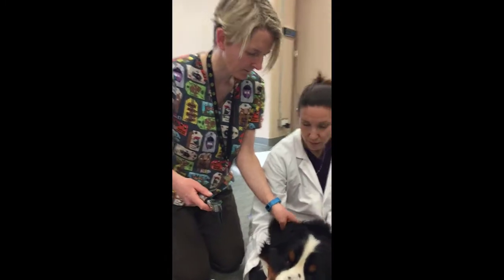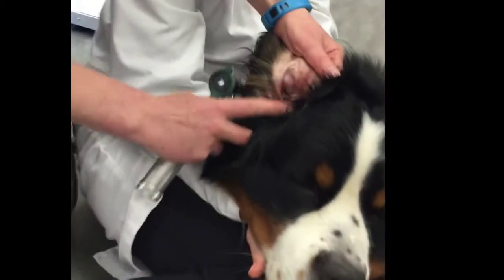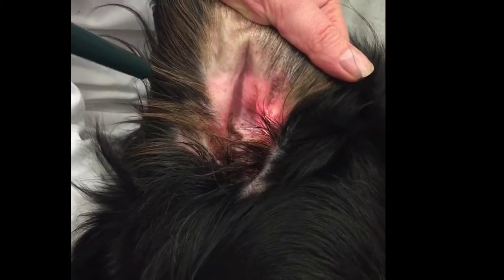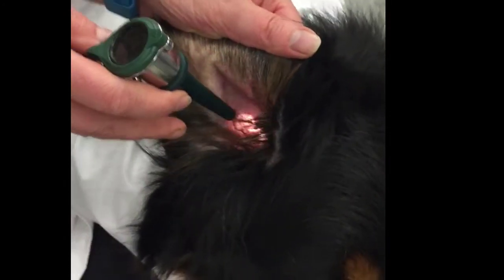Okay, so here we have an ear, which is actually, I don't know if my camera can see, this ear is red. So you can see there's some redness here where I'm shining the light, and there's actually some redness and debris in the ear canal itself. So this is a sore ear.